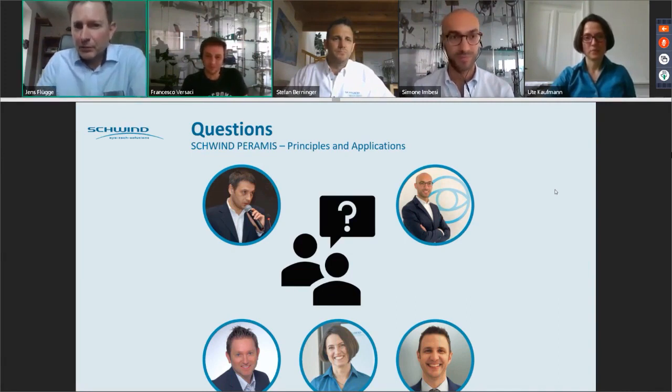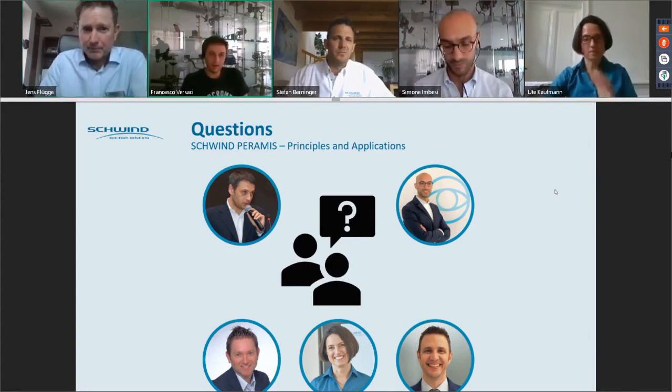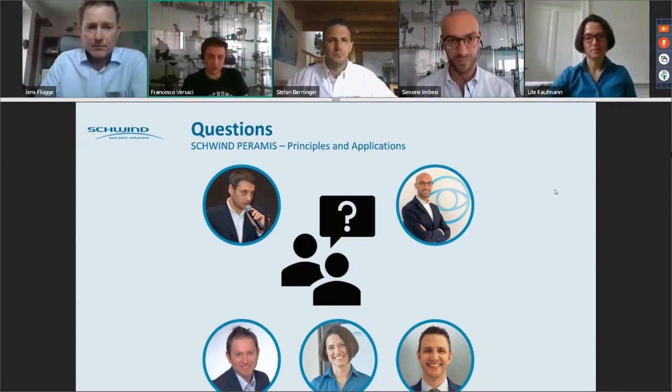So if you have dry eyes, would you recommend using artificial tears, Francesco? If you cannot systematically get a good acquisition, yes. I would suggest artificial tears that do not alter too much the viscosity of the eye, because then I could have a bad effect on the wavefront as well.